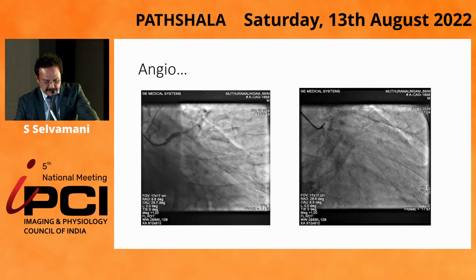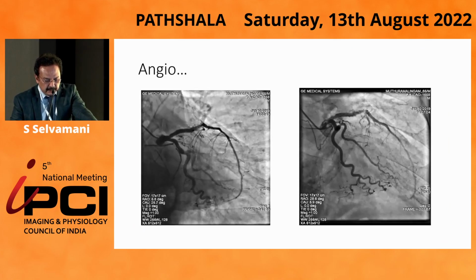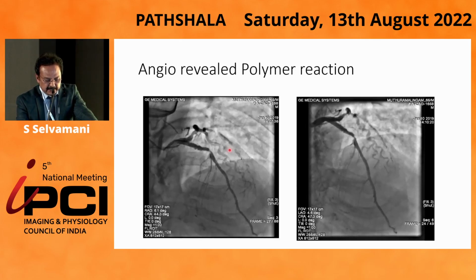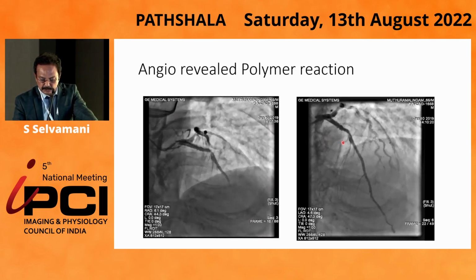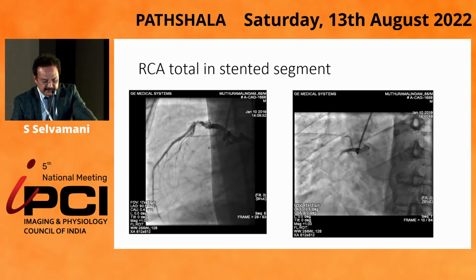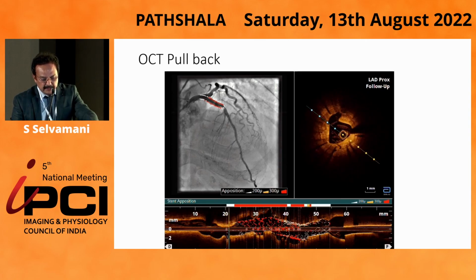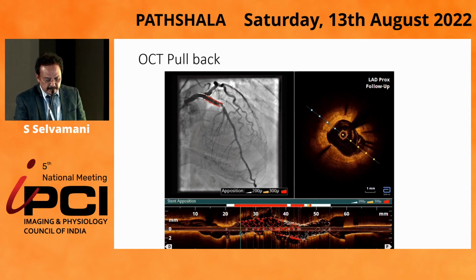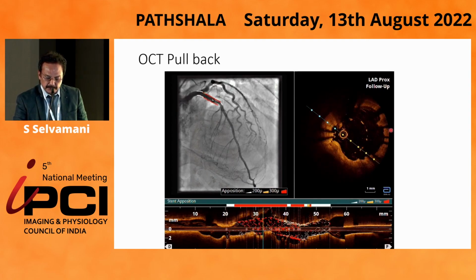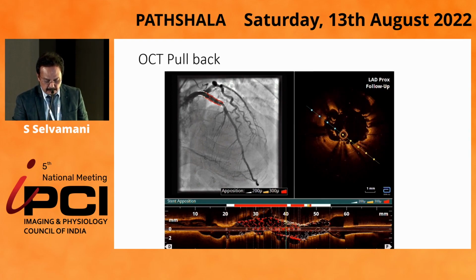And coming to the present scenario, like what Sengatuvel has shown, look at this patient, it is something like that. And Giulio was clearly pointing out that there is something wrong there. You look at this stent edge there, and this case is almost similar. This is 1.5 years after the LAD was stented. And the RCA had a disease, and when we did the imaging, this is what you see there. Just concentrate on this OCT. There are areas of intimal hyperplasia and areas of malapposition, huge malapposition you can see here. And actually the stent is just floating there in the coronary.